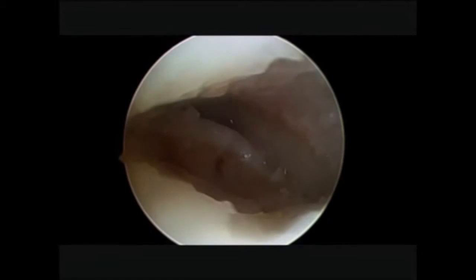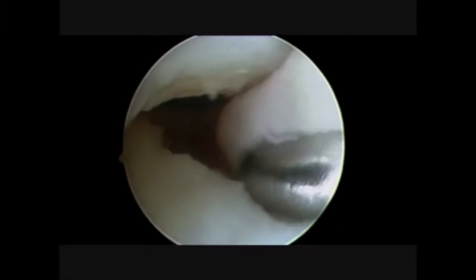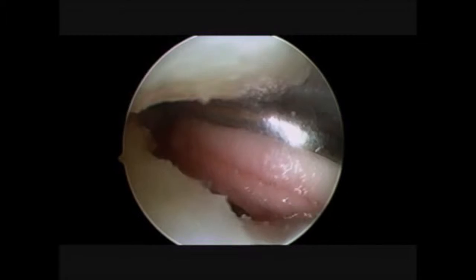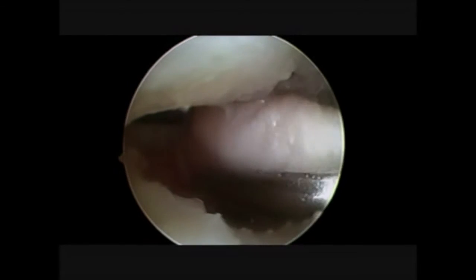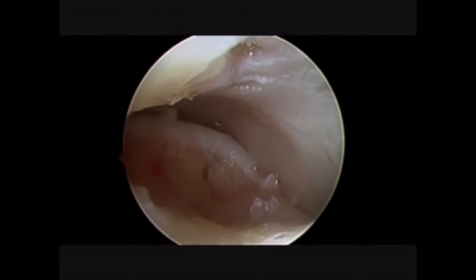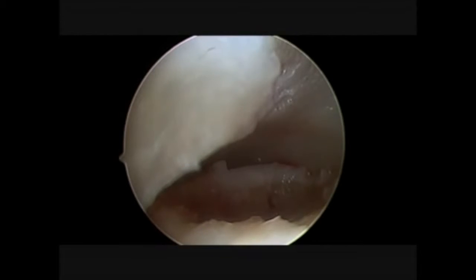From this moment we need a dry joint. That's why we use appropriate suction and sponges to clean the joint from water. As a result we have a stable lesion in a dry joint.